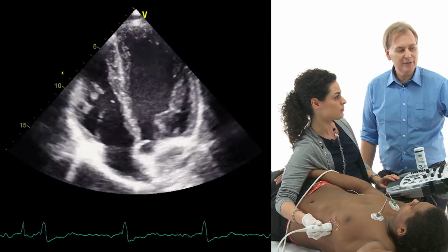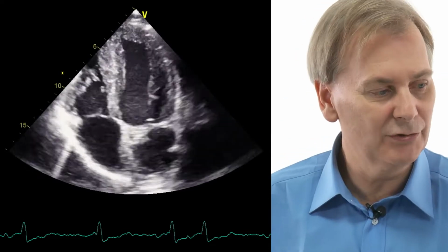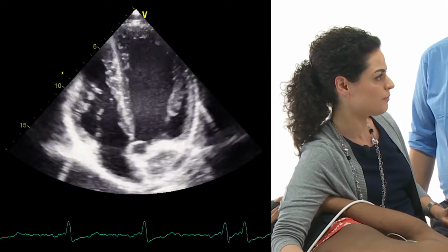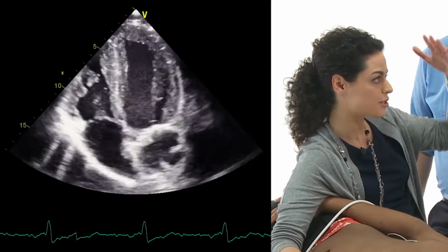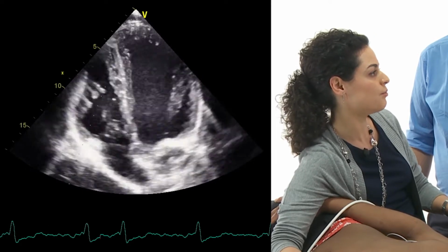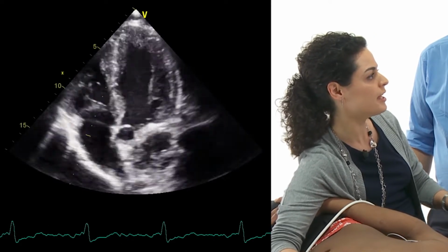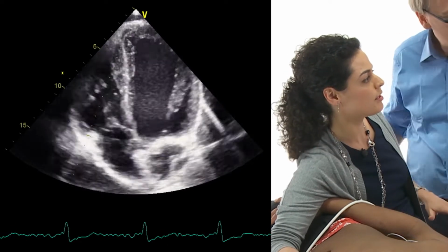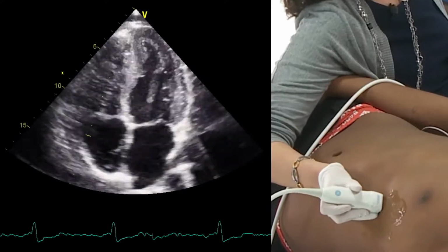Yes, but there's a way where we can really measure this longitudinal function in a relatively simple way. Yes, we use the same excursion of the annulus, but we use the M mode. So we place our cursor, we make sure the ventricle really moves and the annulus moves towards the cursor.